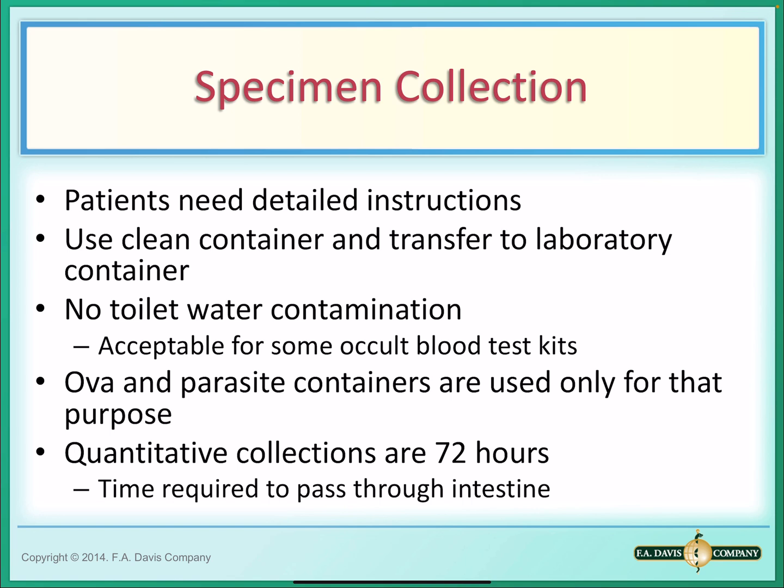Patients must be reminded that care must be taken when opening any fecal specimen to release gas that has accumulated within the container slowly. Patients must also be cautioned not to contaminate the outside of the container.